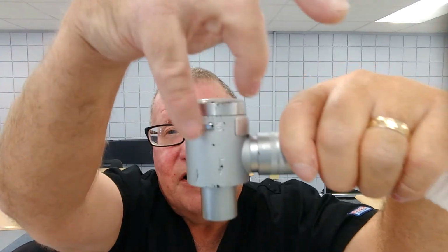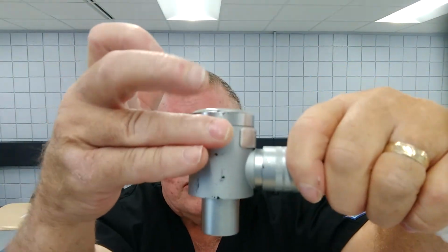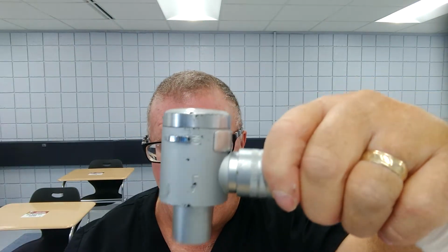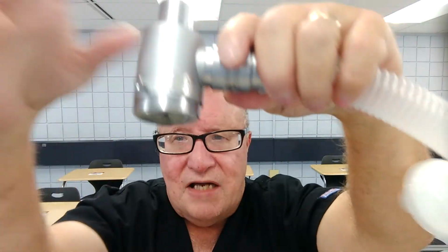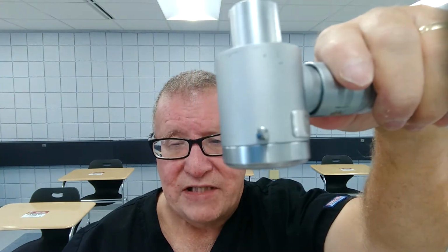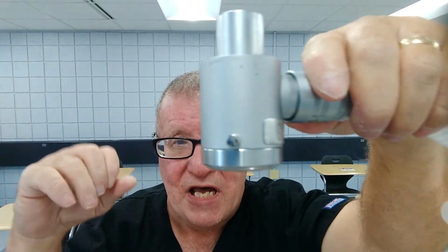All right, now, when you look at these, every one of them, on the side, right here, has an on-off button. And that just toggles over, on and off. So when you're ready to do the test, you're going to put it to on mode. On this side, there's a little button. That button's like a stopwatch button. If you're trying to see how fast somebody can run and you press it and it stops, essentially the same thing. It's used to reset the numbers.